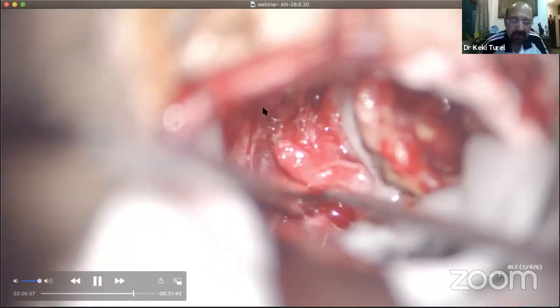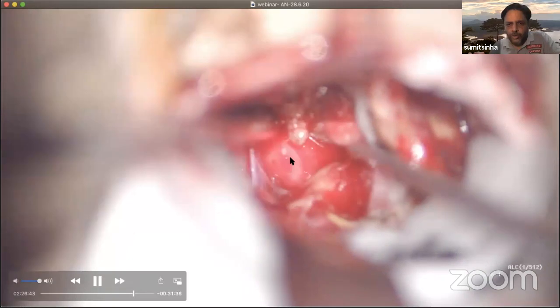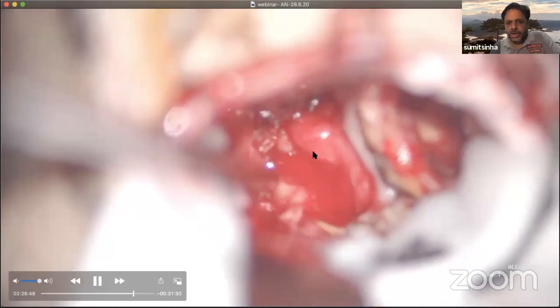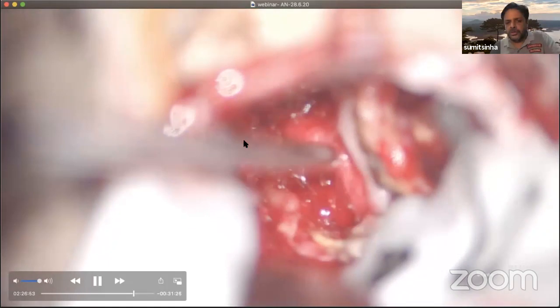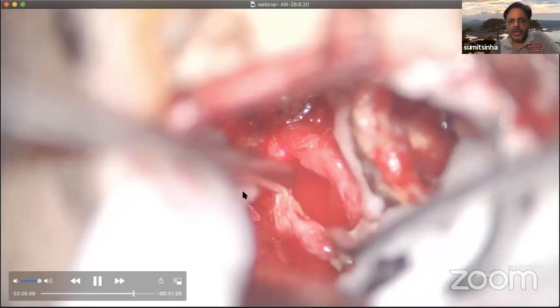May I make a comment on this point? Just a minute. I want to show this is the arachnoid of the anterior portion of the tumor over here, completely preserved, and the vascular structure on the upper pole of the tumor, the superior cerebellar artery, is beyond this arachnoid membrane.